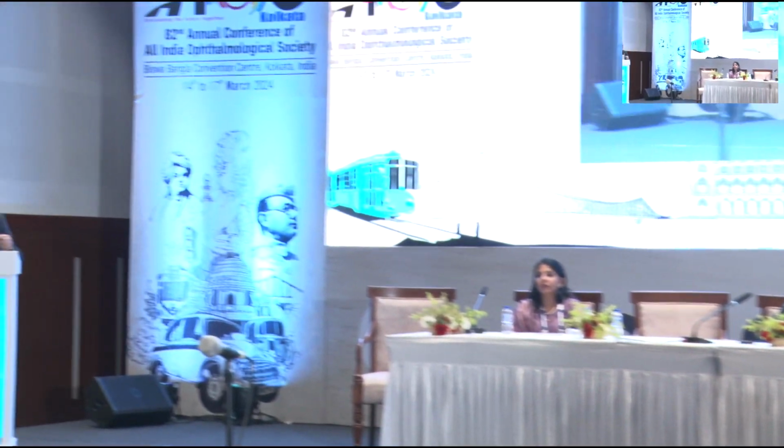So that is pretty simple. Like we had shown in our earlier talk also, the initial part is getting used to the endoscope and getting an orientation done. Before you enter the eye, it becomes important, because we are not visualizing head on, we are visualizing end on. So you are seeing the screen and seeing what's there in front. Before you enter the eye, it becomes important for us to orient our endoscope so that what we are visualizing is absolutely the same as what we see on the screen.